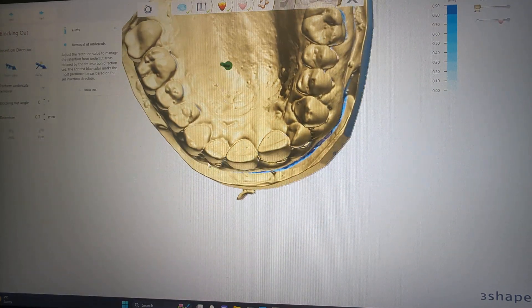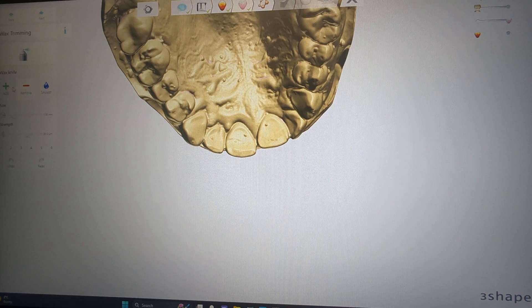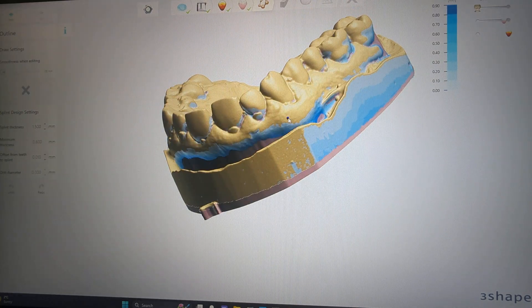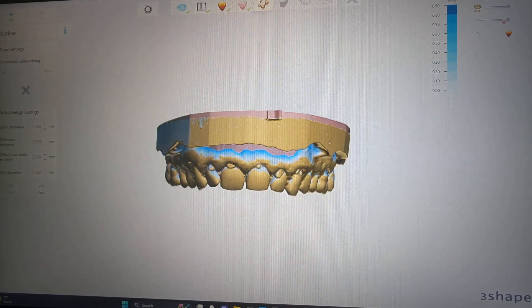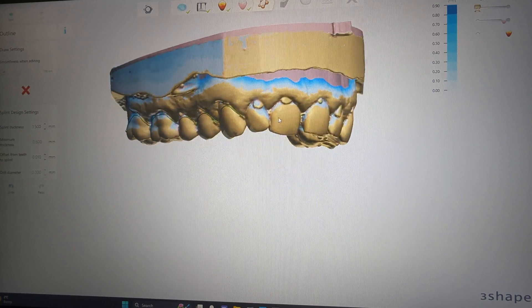I basically go with whatever parameters are there. Retention I set at 0.7 — I believe it does matter as to the actual printer you're using. I decrease this and do a little wash in the sulcus, just because I find it impinges a little bit, so let's just remove that. Otherwise I go with whatever the computer suggests. I like a nice little scallop around the buccal of all molars and I include the cuspid slightly.